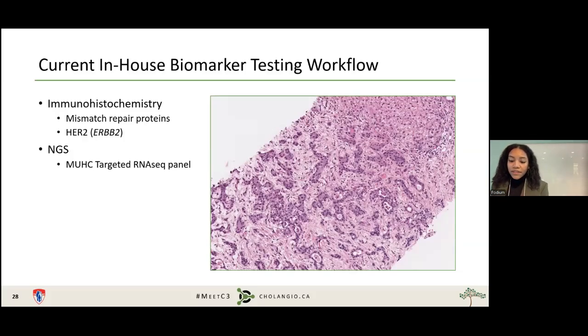What that means for us in-house is that if I look at this biopsy that you see on your right, you see a little bit of, I don't know if you guys can actually see my arrow. Yeah. So it's lagging. So there's a little bit of normal liver here on the right, and then you see these atypical glands that are chewing up the liver. That's the actual cholangiocarcinoma.